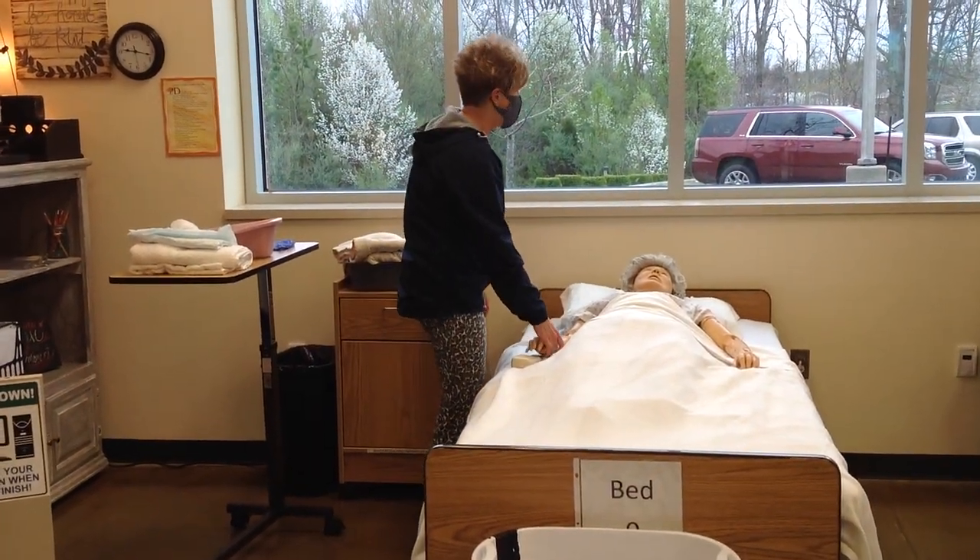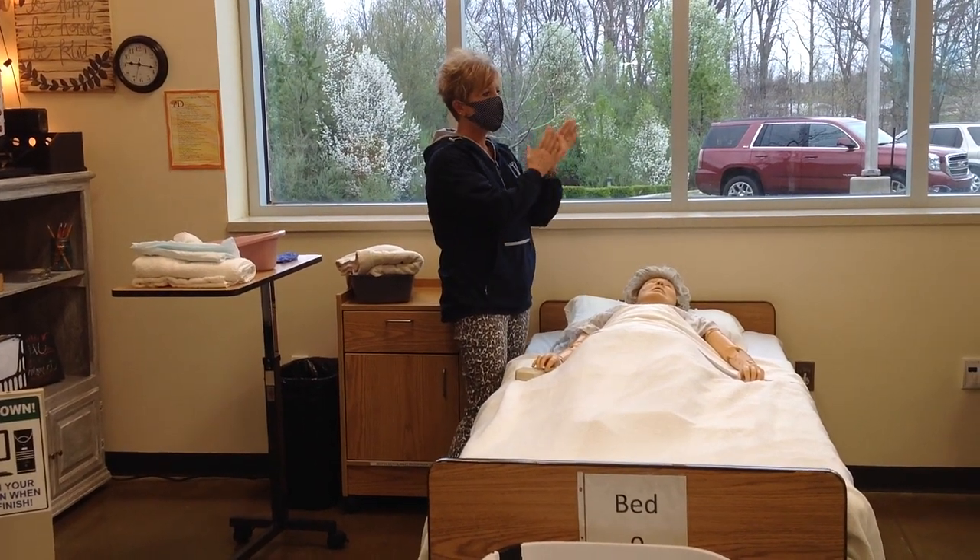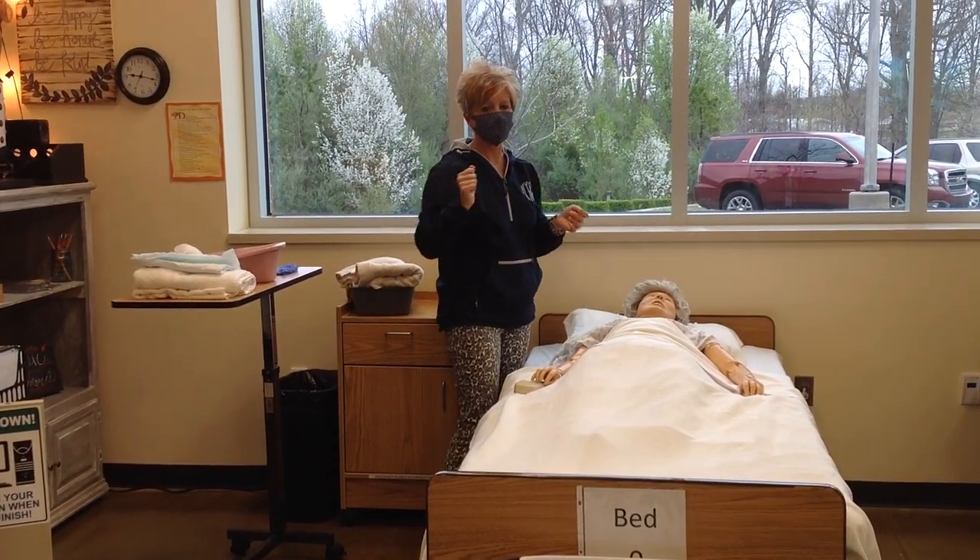Hello, Mr. Freely. My name is Blanca Hall. I'm a nursing assistant today and I'm here to put you on the bedpan. I'm going to wash my hands and I'm going to provide for privacy.